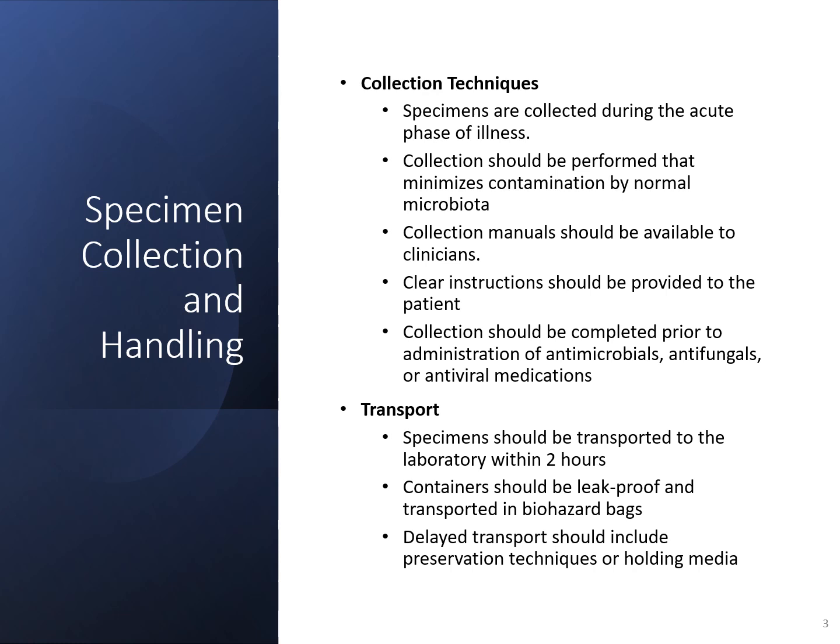In some cases, the patient may be the person who's collecting the specimen, for example with a stool specimen, so those instructions should be very clearly written for those patients. And the collection should be completed prior to any sort of treatment, so before antibiotics are given, or before any sort of antiviral or antifungal medications are started. Specimens should be transported to the lab usually within about 2 hours, just to make sure you can maintain the viability of that sample.